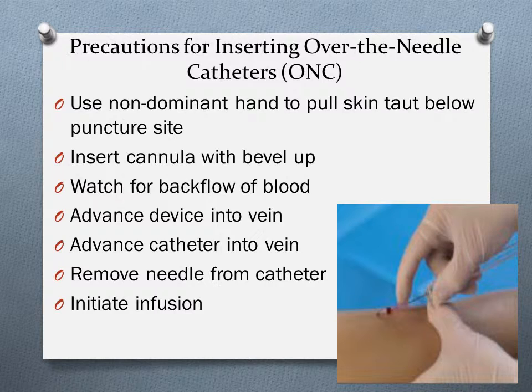Well, one of the things that I want to leave with you with IV therapy is there is no such thing as a vein that rolls. It is a vein that just does not have the right stabilization maintained on it during cannulization. So if it rolls, then you're not anchoring it appropriately.